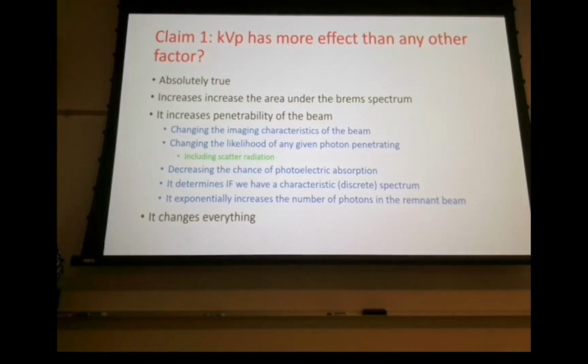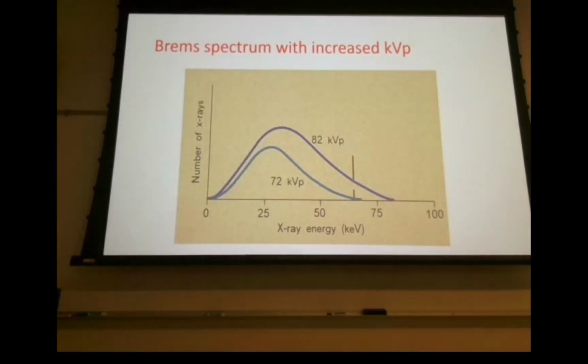So if you shoot with low kVp, you're going to create scatter, and that scatter is not going to exit the patient. If you shoot with high kVp, even if you create the same amount of scatter, which we're going to look at, that scatter is more likely to exit the patient. So, did scatter go up? No, it didn't really go up, but the scatter to the image receptor did. That makes sense. And again, we'll get there in a second.